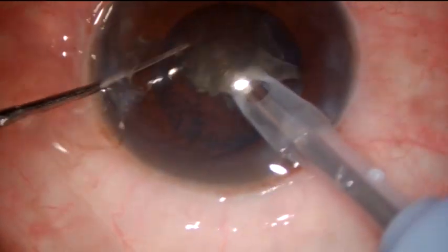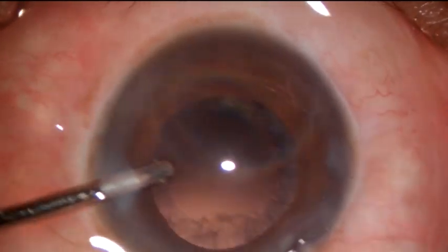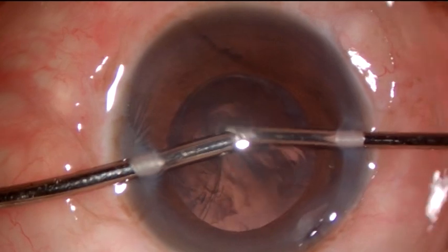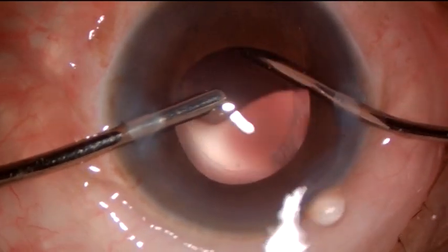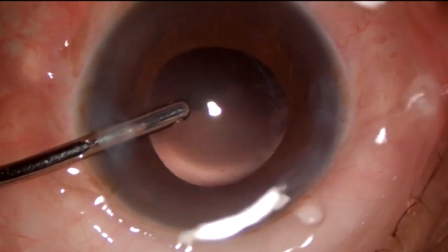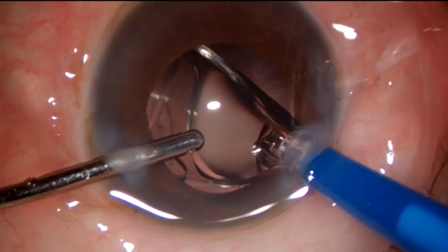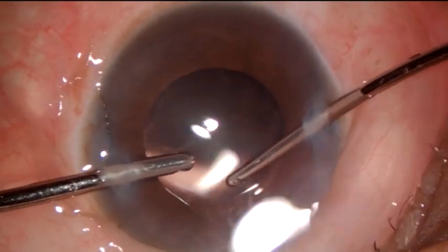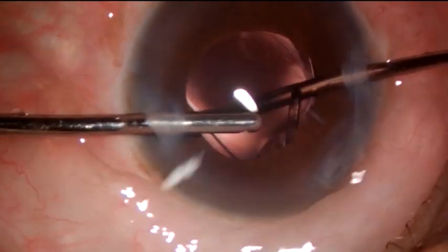All intraocular lenses can be easily injected under BSS. Only those IOLs which require a rotating movement with a second hand cannot be injected under irrigation. Continuous flow of fluid in the anterior chamber during intraocular lens implantation helps in bringing peripheral small cortex or epinucleus from behind the iris to the center, particularly in mature cataract.